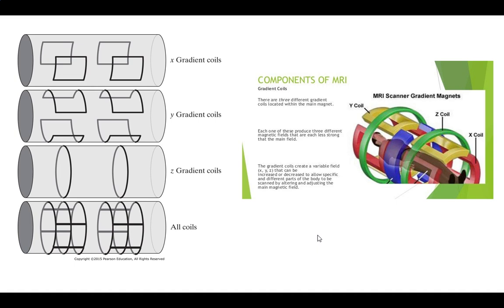So for the gradient coils, is there a similar type thing where we're assuming a planar gradient and it's not actually, is that something that's strong enough that needs to be corrected, or is it generally just? It's usually fairly close. Okay. There's always, I have to hem and haw a little, right? There's always going to be some variation within there. And we try to adjust them.